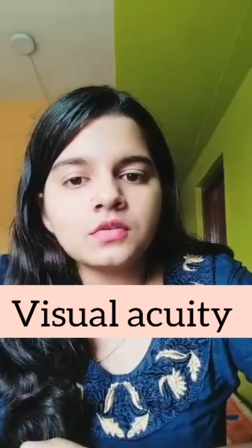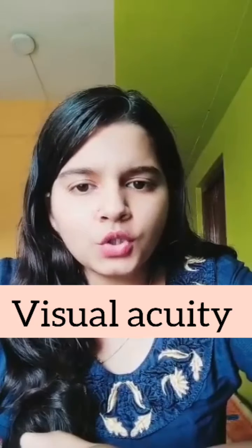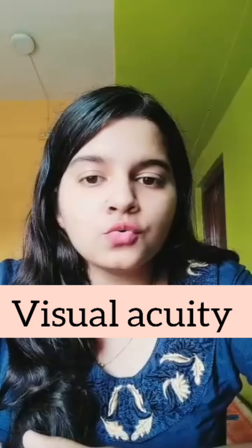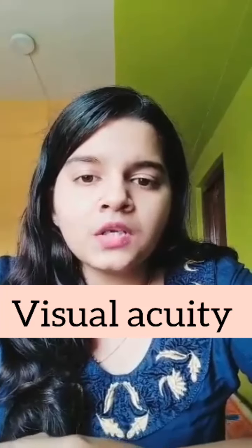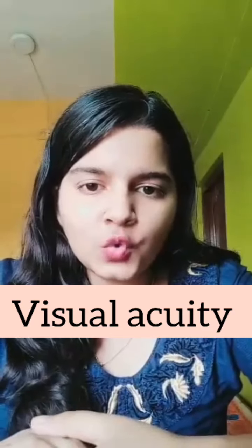So after knowing all these answers, we move towards the visual acuity part. This is done for both distance and near. So let's talk about the distance visual acuity assessment first. This is done both monocularly and binocularly. The most important thing here is the room must be well illuminated, and then we give a target to the patient that is at a 3-meter distance. The patient is told to read. If they have any refractive correction, they are allowed to wear that.